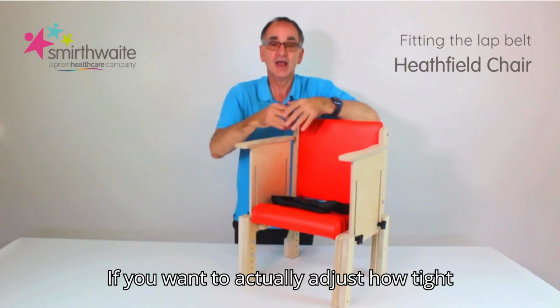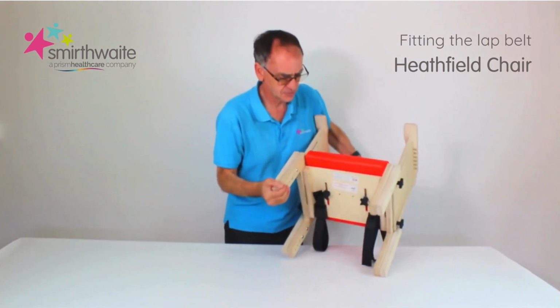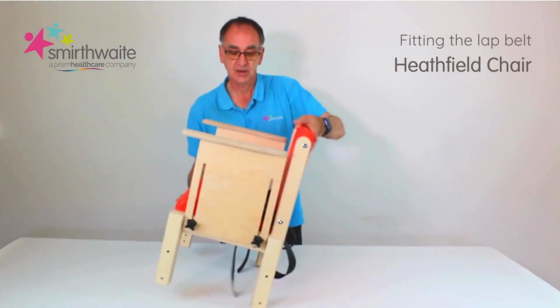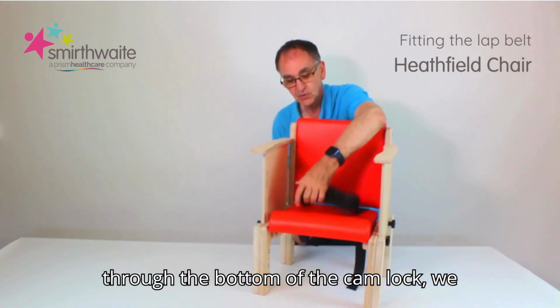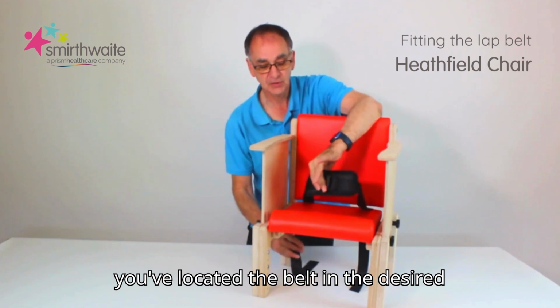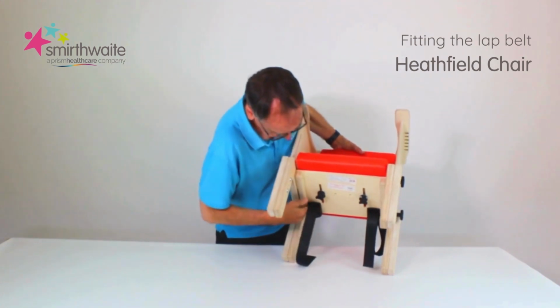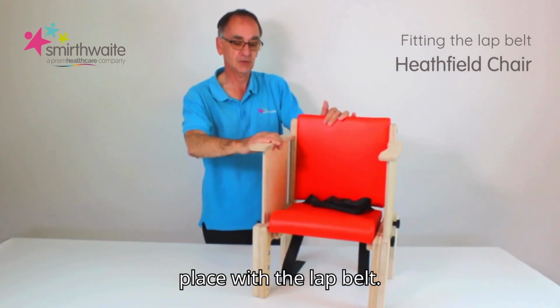If you want to actually adjust how tight the belt is, underneath the chair, again I'm going to tilt this back, don't do this with a child in it, you've got 2 cam locks which come undone, and then by adjusting the length through the bottom of the cam lock we can adjust how tight you need the belt to be. So once you've located the belt in the desired location, it's simply a question of locking off the cam lock underneath, like so, and then your child will be securely held in place with the lap belt.